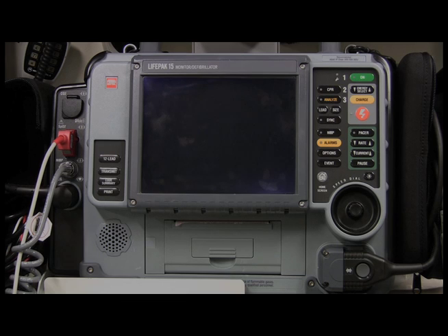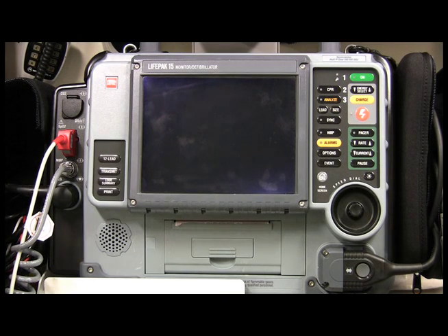Hi and welcome to how do I use a LifePak 15 for BLS providers. We want to go ahead and turn it on.